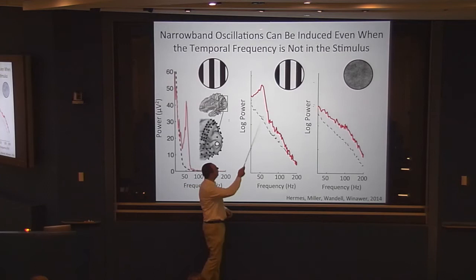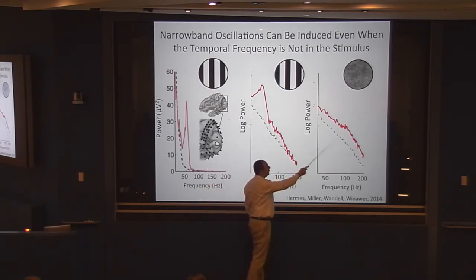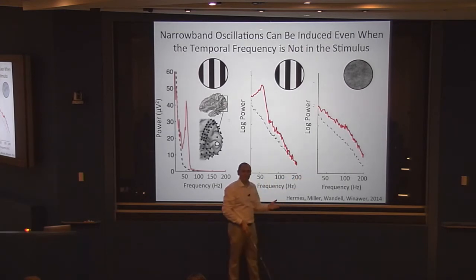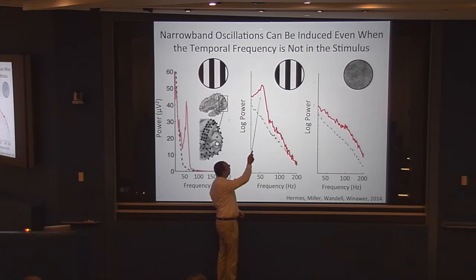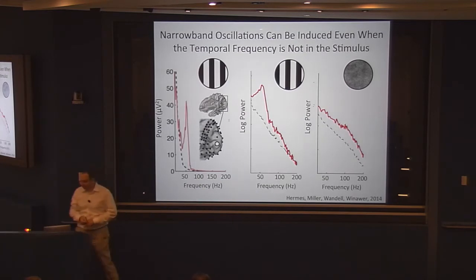But if you try to dissect the spectra in terms of component processes and say, well, I think there's a broadband thing here plus a narrow band thing here, and only a broadband process here, you'd arrive at a different interpretation, because the biological interpretation for what causes these oscillations is very different than the interpretation of what causes these broadband spectral changes.